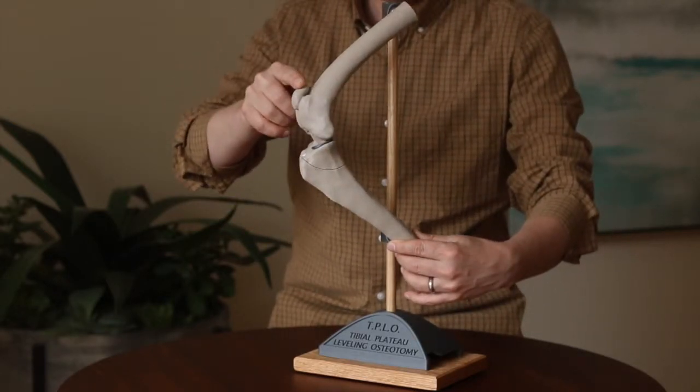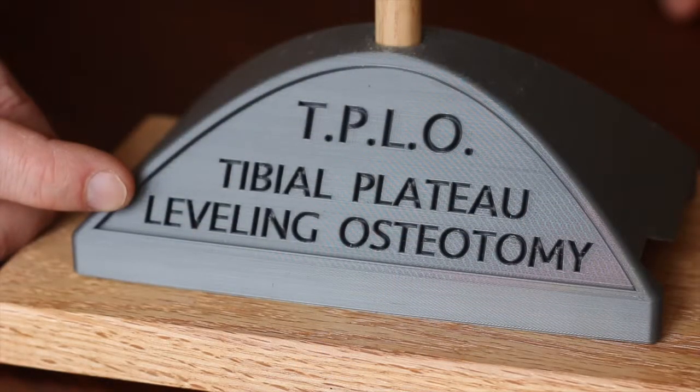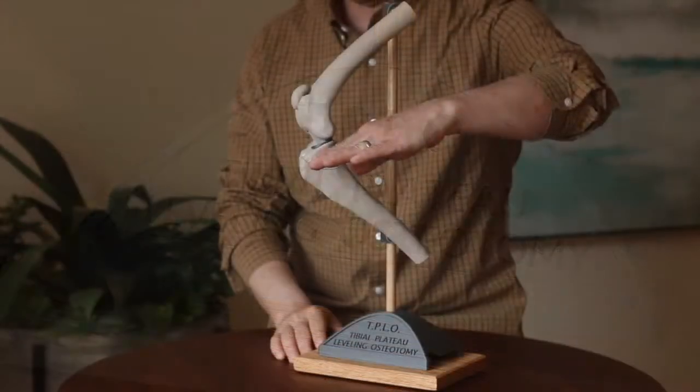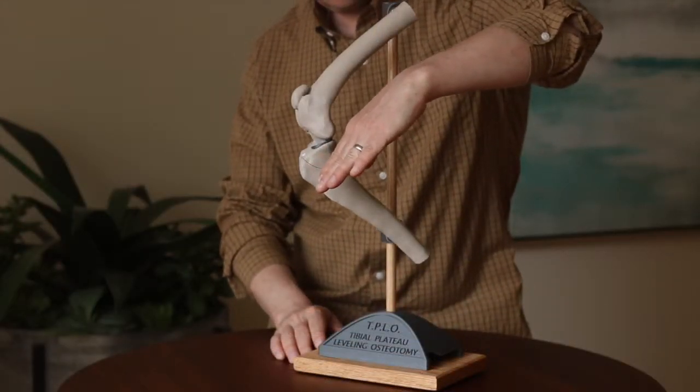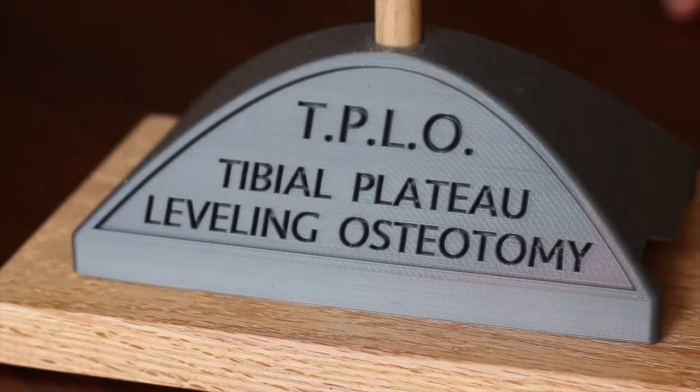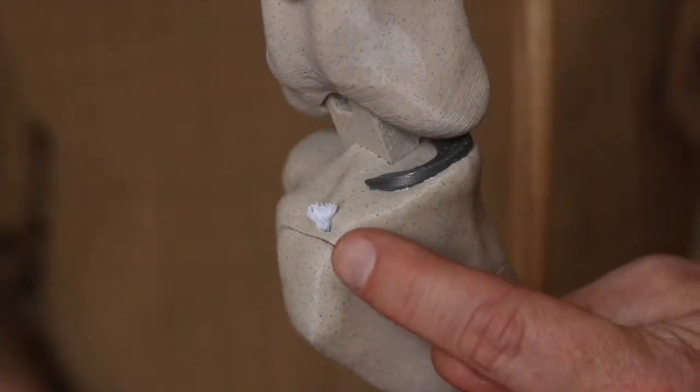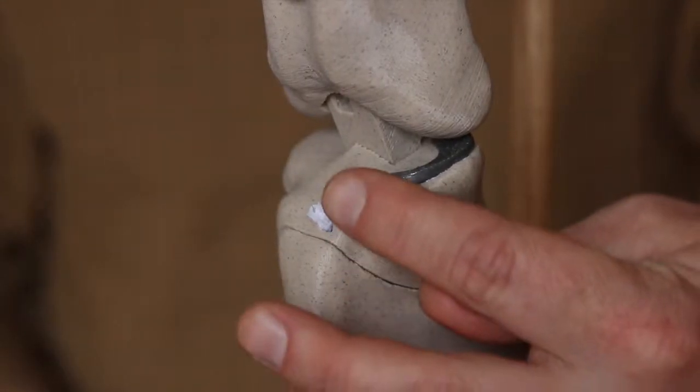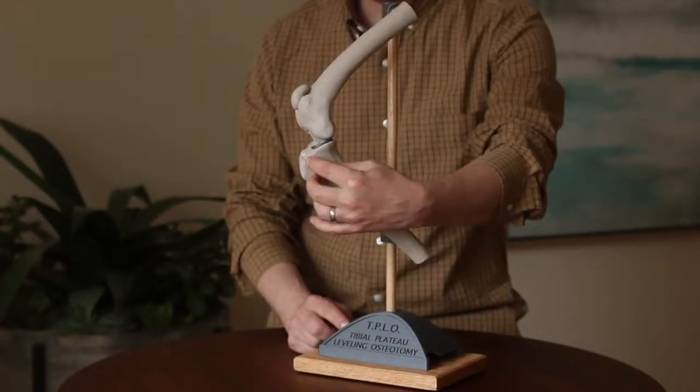So the goal of the surgery is to level that slope like so, so the femur does not tend to shift. And we do that by making an osteotomy, or a cut in bone, and that's this arc-shaped cut you can see right here. So in surgery we make that cut.